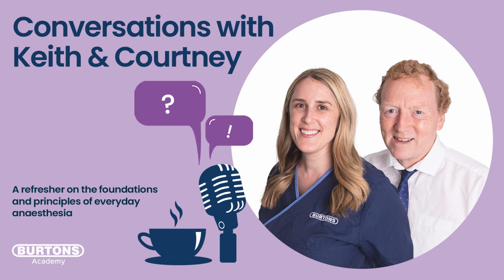Okay, and if we see molehills, then basically we know what we're actually looking at is not a true representation of what's happening in that patient. We've got an effect there from our monitoring apparatus, which is imposing a different appearance to the capnogram, not a true reflection then of what's actually happening in the patient. And that's the same as side stream sampling.